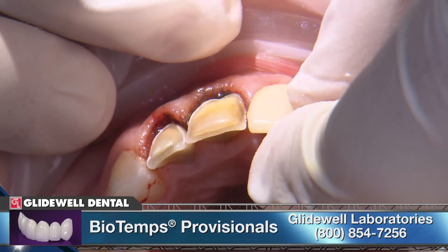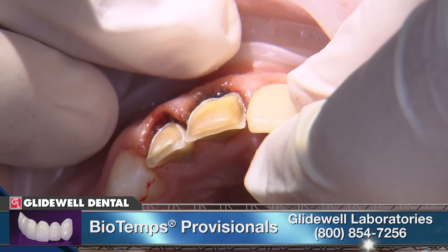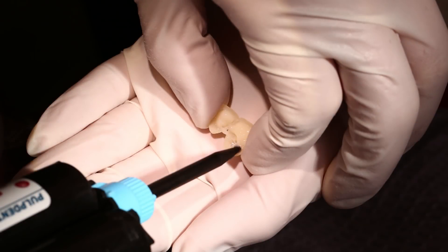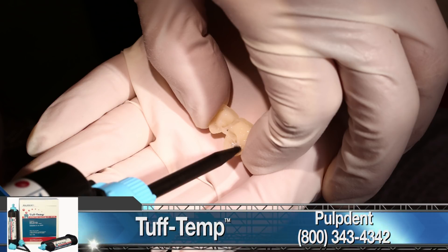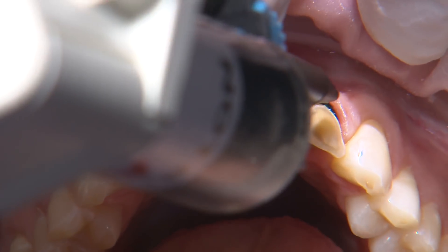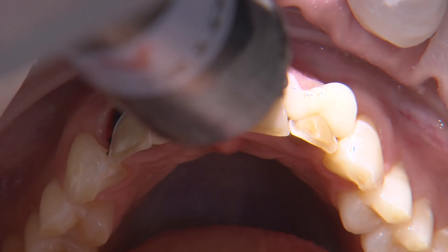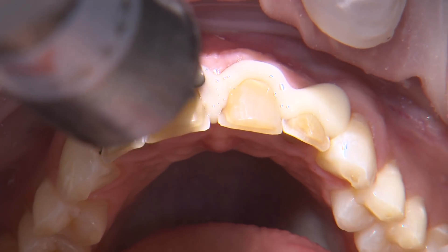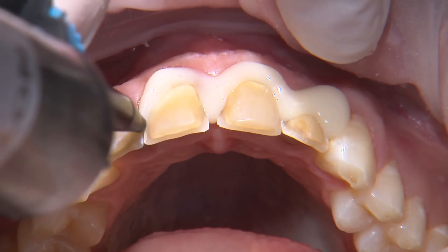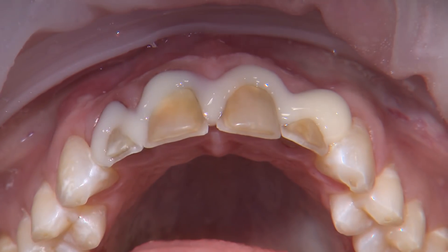After the impression is taken, I try in the BioTemps to verify that there aren't any hang-ups along the margins. When I verify they can be seated in the correct position, I clean and dry the shells really well and then reline the temps with dual-cure bisacryl temp material — here I'm using Tuff-Temp by Pulpdent. Using a technique I picked up from USC Dean Dr. Avishai Sedan, I float the material along the margins first like a light body impression material and then seat the shells. I found this helps minimize bubbles along these areas.